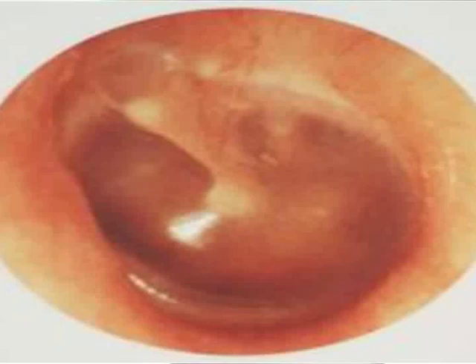The other thing you must also observe on the tympanic membrane is the light reflex. Now the light reflex on the tympanic membrane, on the left ear, will be in the 7 o'clock position. The light reflex is the reflex of the otoscope on the tympanic membrane. If it's the left ear, it will be in the 7 o'clock position. If it's the right ear, the light reflex will be in the 5 o'clock position.